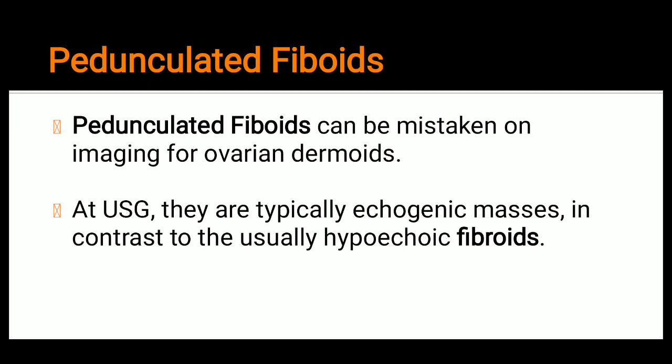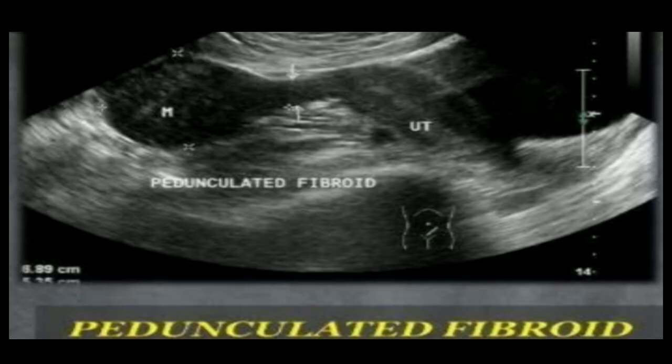At ultrasound, pedunculated fibroids are typically echogenic masses, in contrast to the usually hypoechoic fibroids. You can see these echogenic masses — slightly brighter as compared to the well-defined hypoechoic masses. Due to their specific location, we can identify these as pedunculated fibroids.